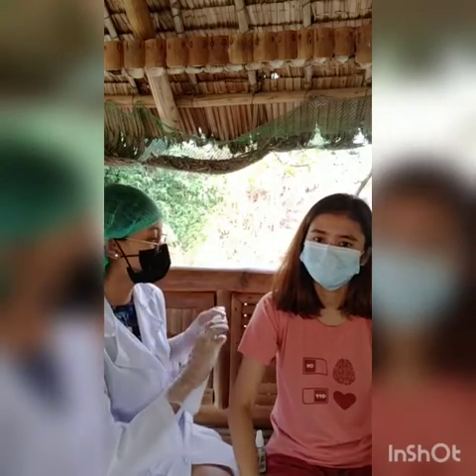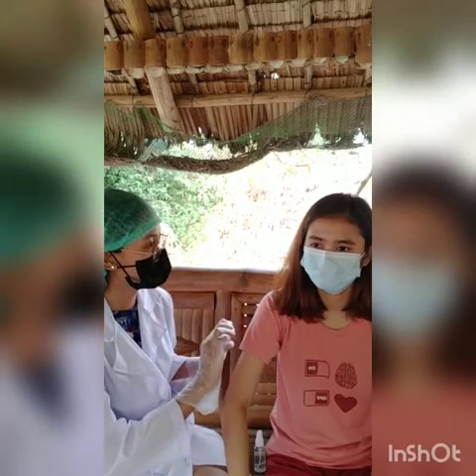So, check lang po natin, ma'am, kung naka-uncross po yung paa ninyo. Dapat po naka-uncross. Then, after that is expose the brachial artery by removing clothing or moving a sleeve if it is not too tight above the area where the cuff will be placed. So, ma'am, i-roll ko lang po itong damit ninyo para po masimulan na po natin yung blood pressure po.